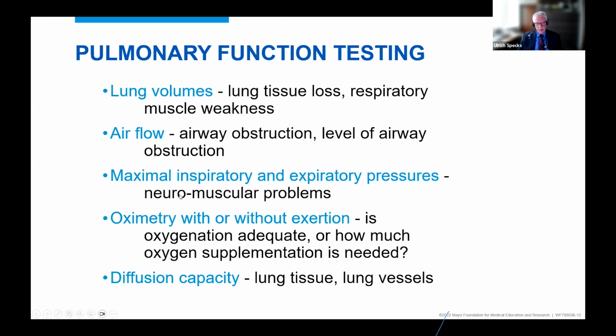We can have you do a maneuver that's called maximal respiratory pressures, where we essentially measure how much pressure you're able to generate breathing in and how much pressure you're able to generate breathing out. And this is a marker for how strong your respiratory muscles are.